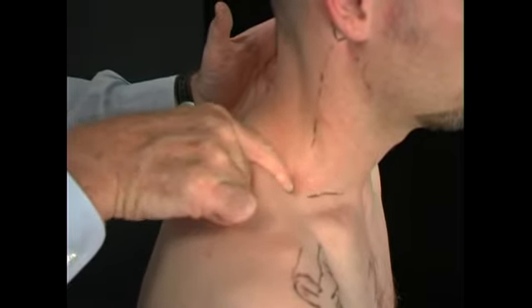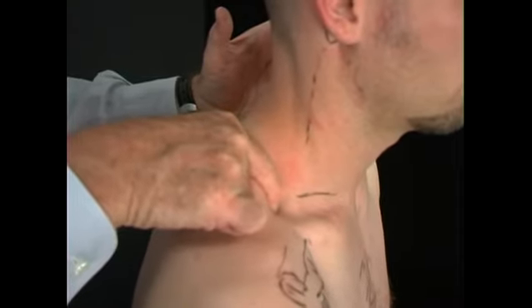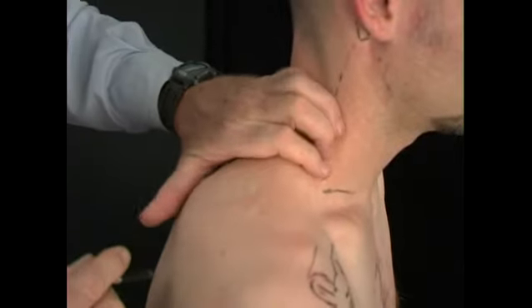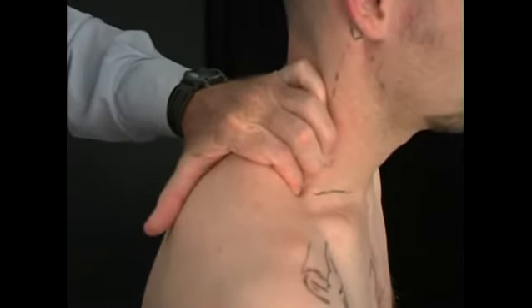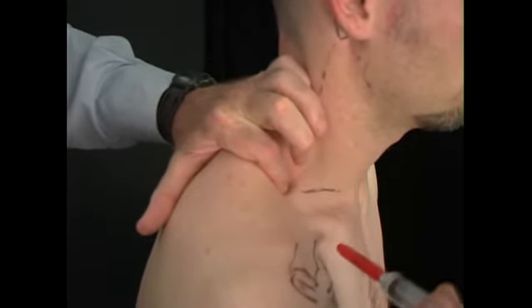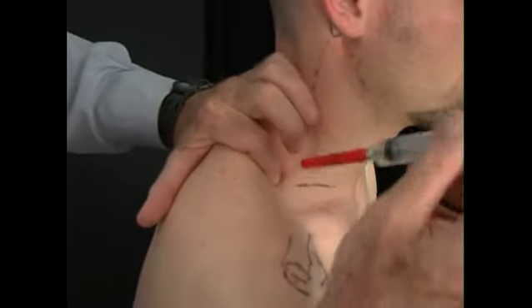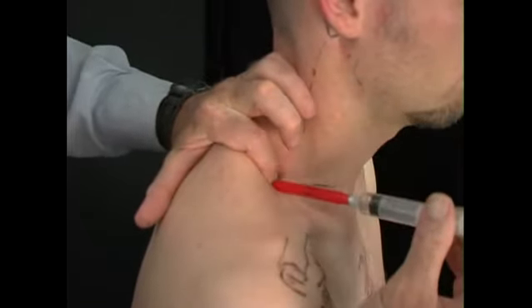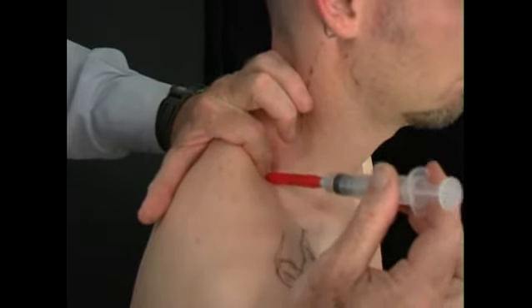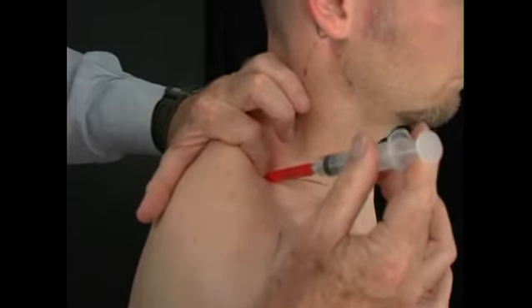It's a firm bump, and if you drop off it then, right there you're on the first rib, and that can also be quite painful, the scalenes coming off this area. So to inject this area in the sitting position, we come in and find that bump. You can use a 27 gauge needle, a shorter needle here. This will not be a deep injection. Keep your finger right on the bump and come in aiming a little caudally and a little medially, right down in front of your finger, right onto the tip of that C7 transverse process.